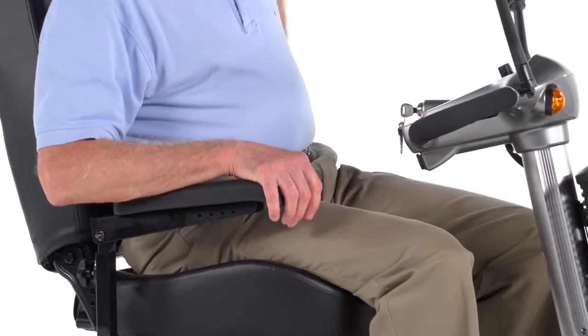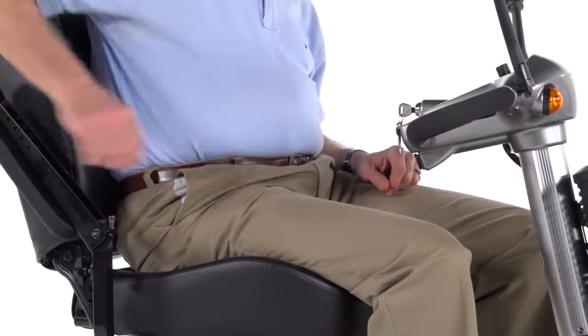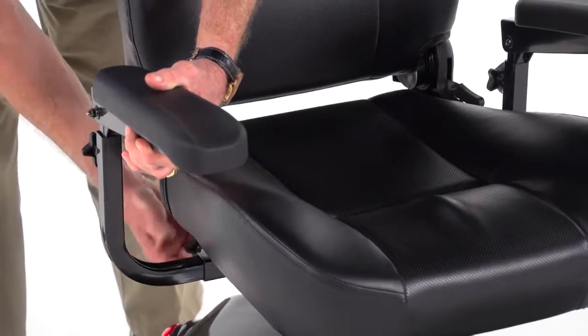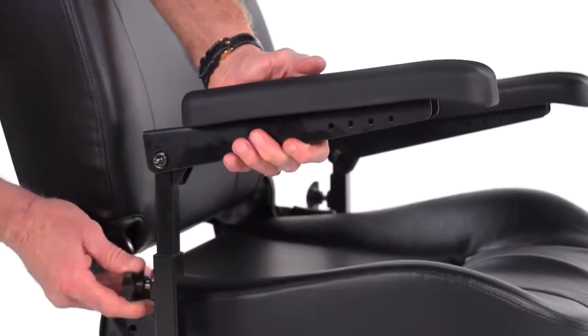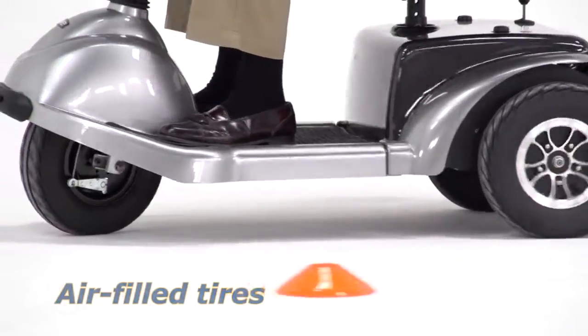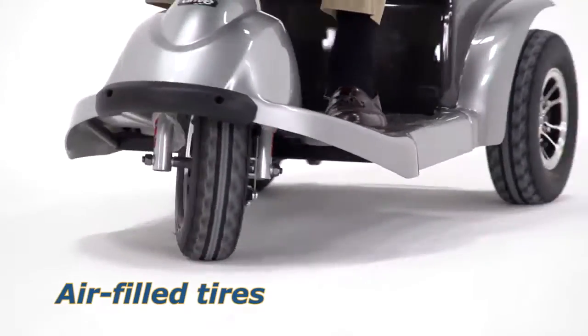The padded contour armrests flip up for convenient boarding and exiting of the scooter, and the armrest width can be adjusted to best fit the user. The armrest height can even be adjusted for added comfort. Air-filled tires ensure a smoother ride over outdoor surfaces.